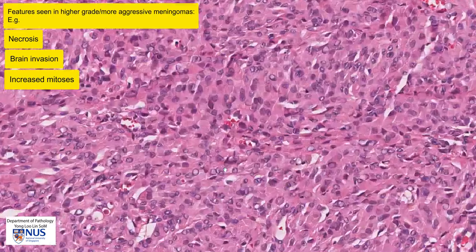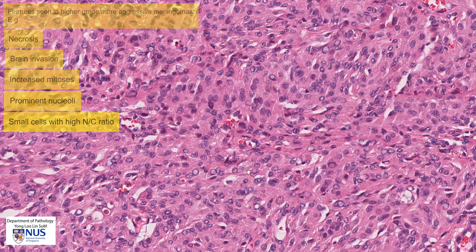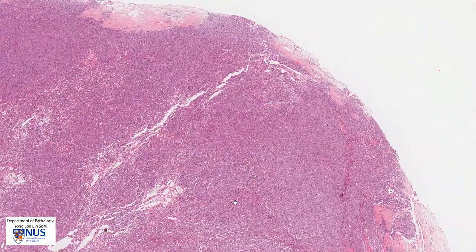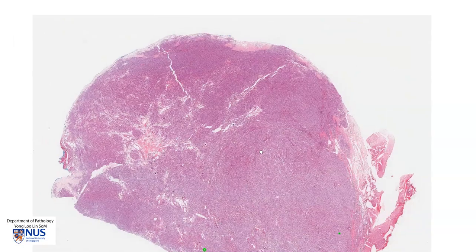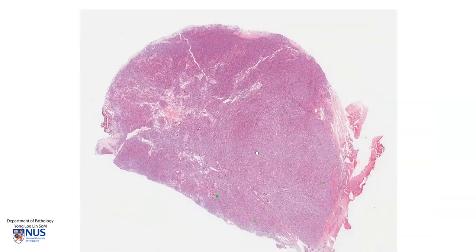Other worrying features include very prominent nucleoli, which we do not see here, and also the presence of small cells with high nuclear-to-cytoplasmic ratios, again something that we do not see here. Therefore, there are no high-grade or worrying features in this particular tumor.